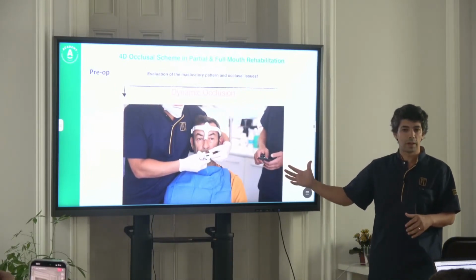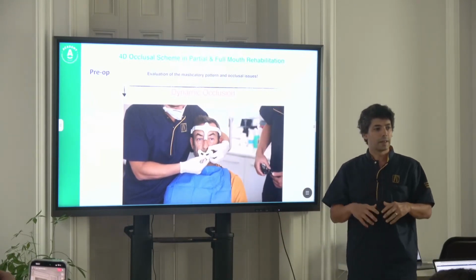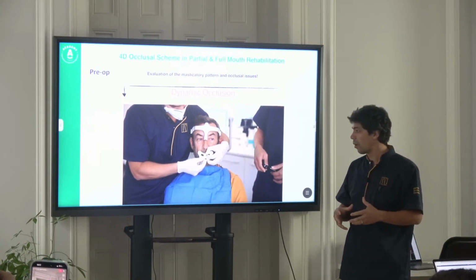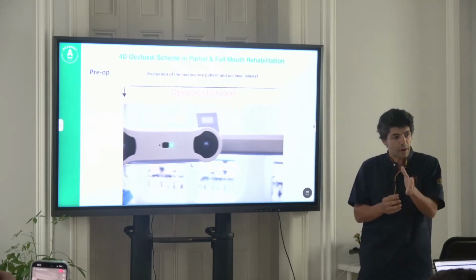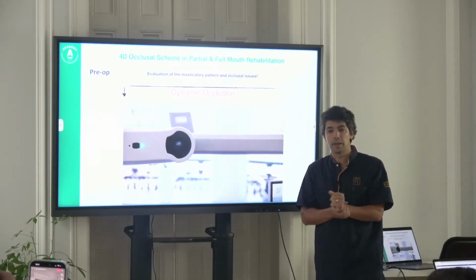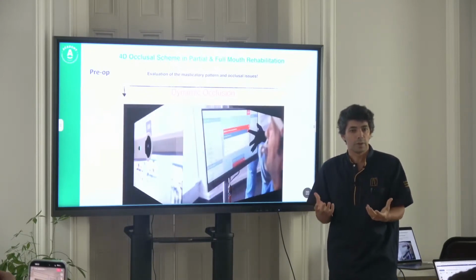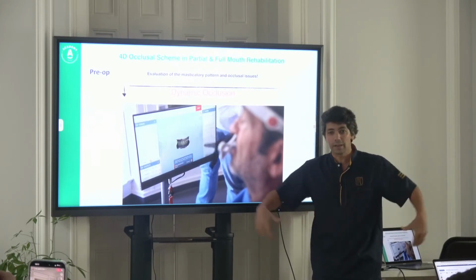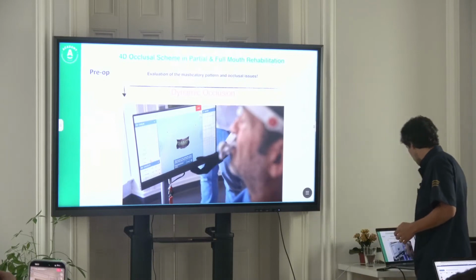nowadays we use 4D assessment software that enables us to bring up the quality of the information into frame-to-frame imaging, which in fact is much more accurate, much more in line with what we search for in the digital environment in which we work.